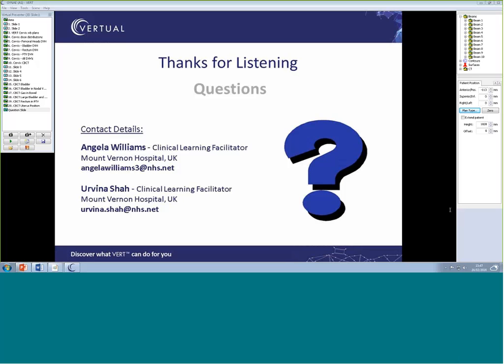Avina, can I ask, how long would you normally allow for a session like this? We've got a cohort of 25 students here. How long should I allow if I wanted to book a session to go through one of these workbooks with my students and get their opinions? As I said, some of this work they can do prior to the sessions, all the anatomy, etc. So the actual VERT session we run for an hour.